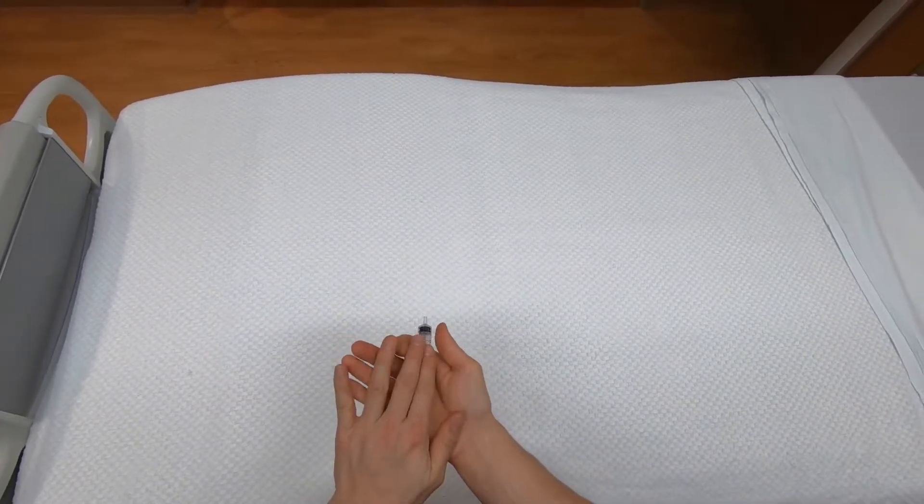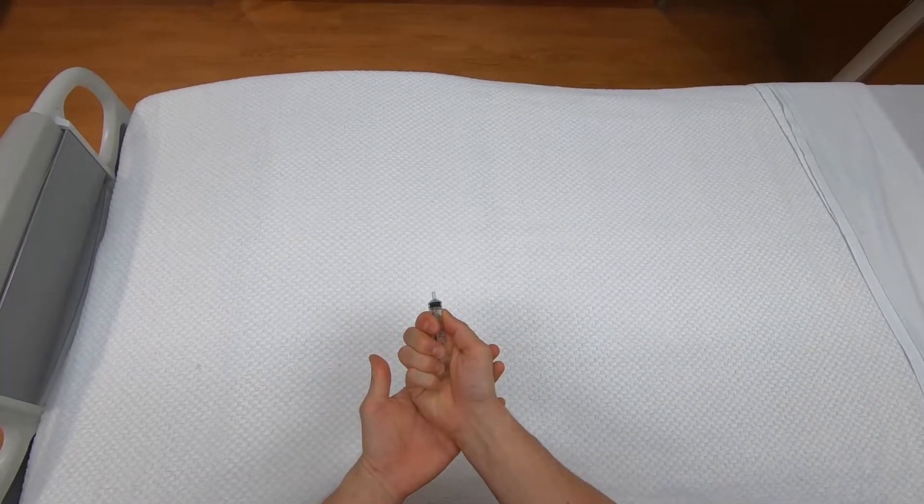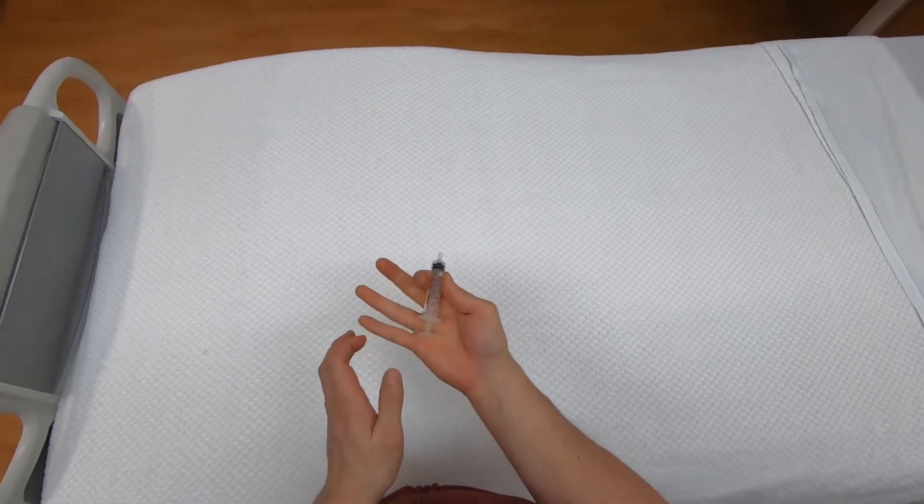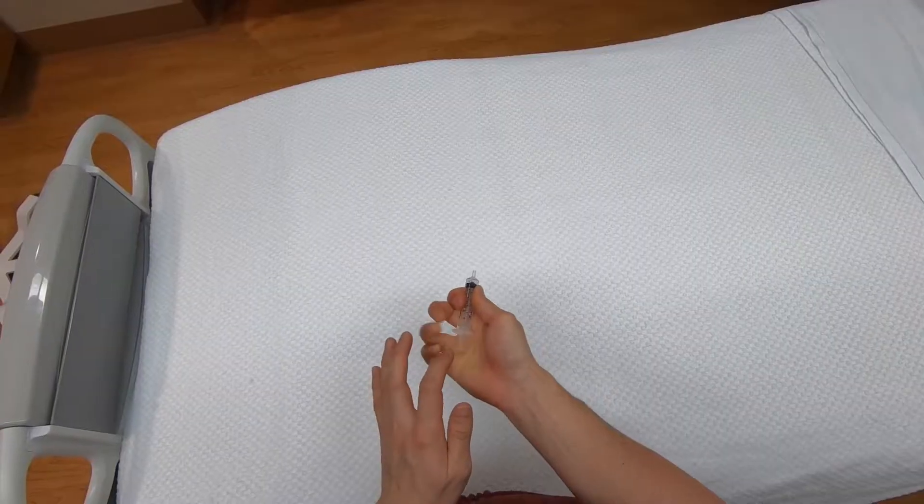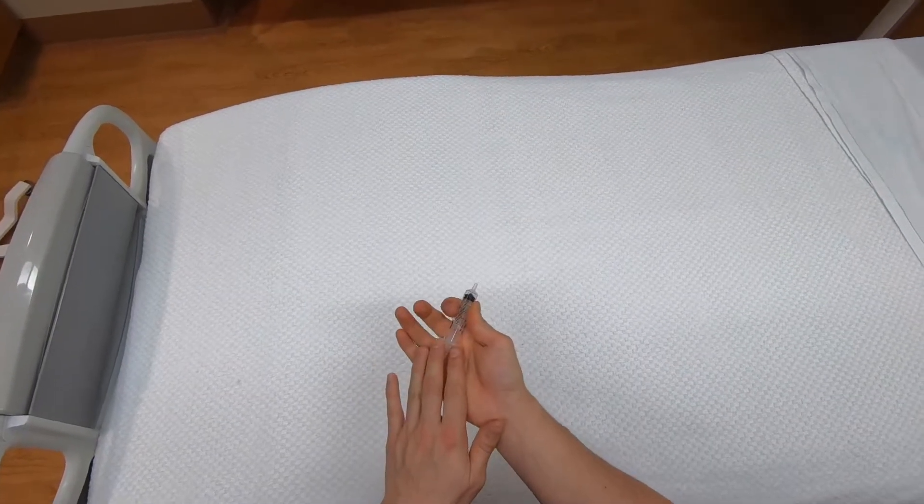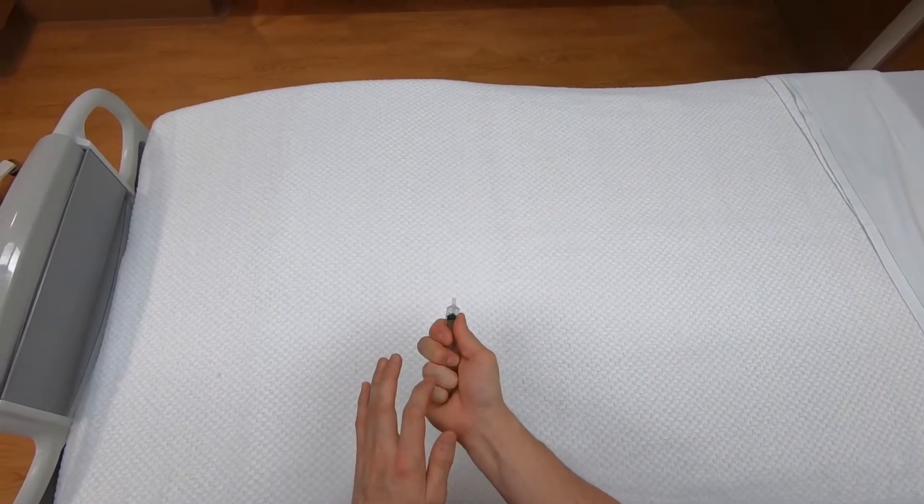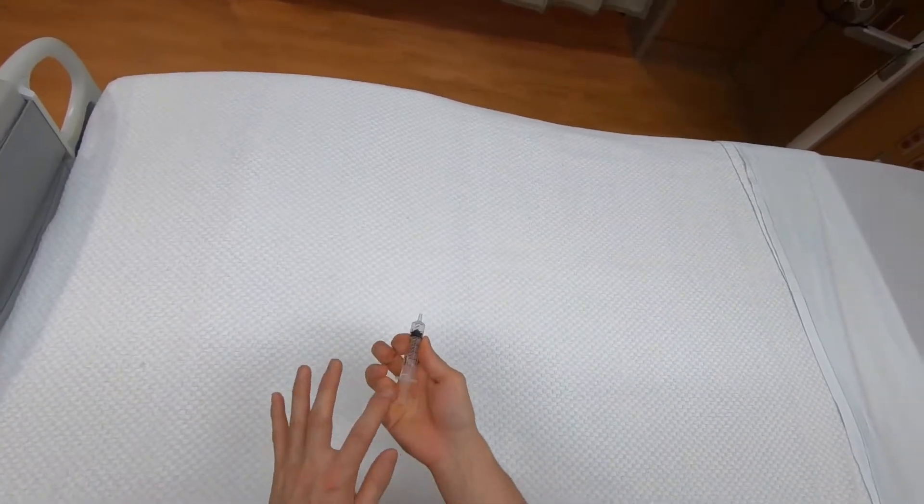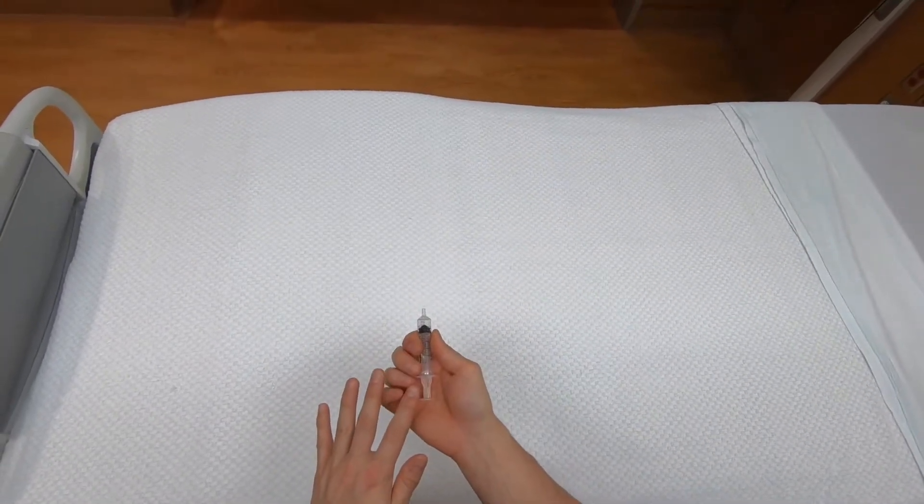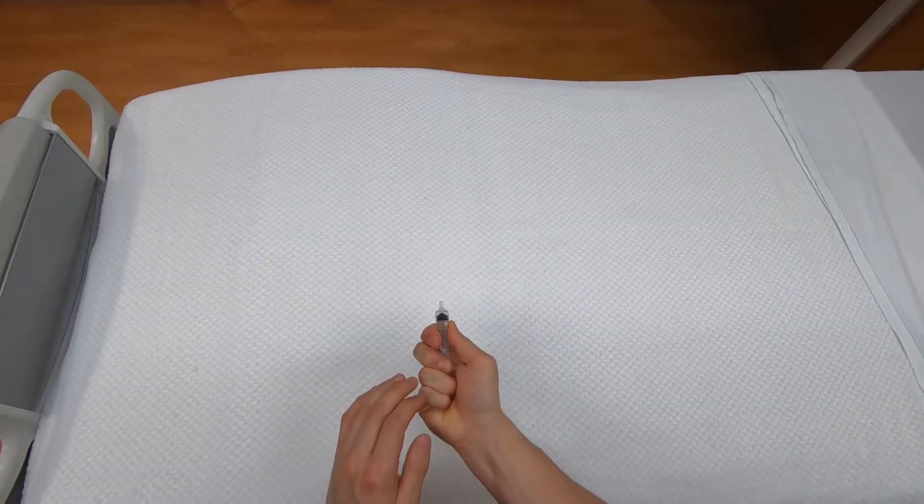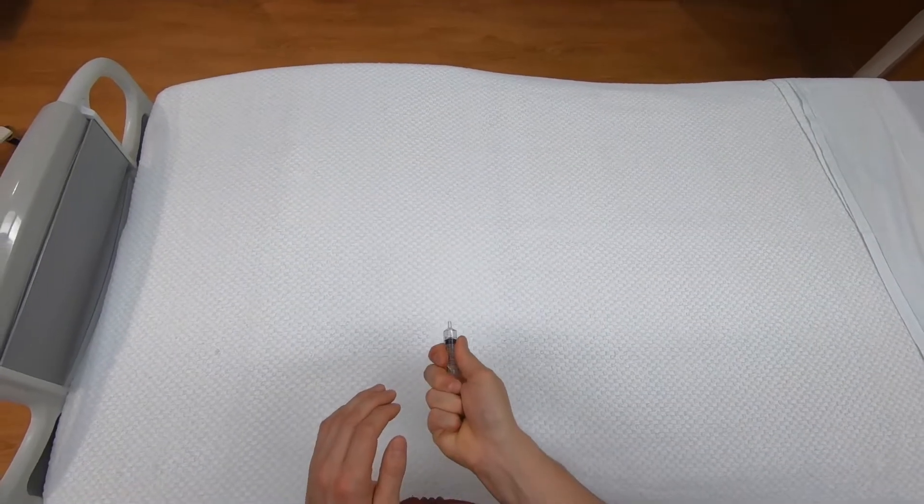The final grip that's sometimes useful is an underhand grip. I'll use this to infiltrate lidocaine at a very flat angle. And if you're good at this grip, you can exert aspirating pressure by spreading your hand apart.